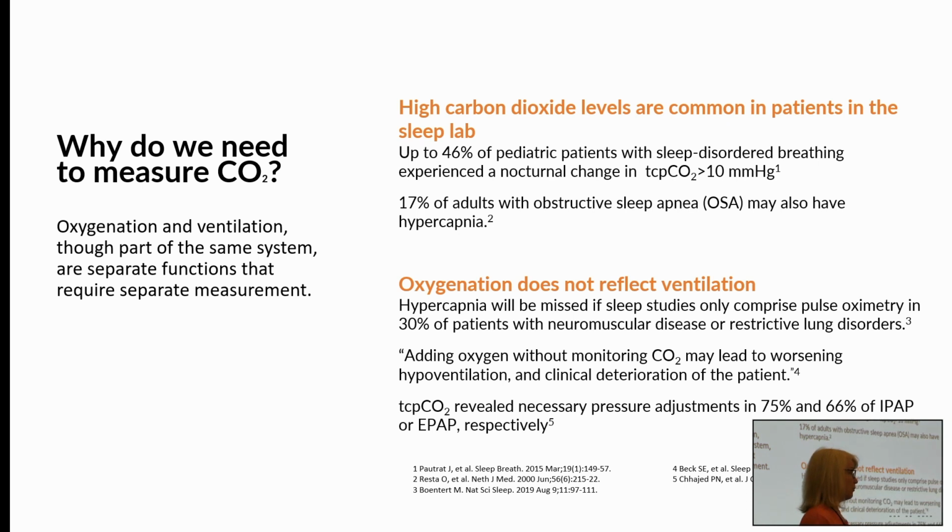Oxygenation does not reflect ventilation. As I said, they are separate functions of the same system. And it's been shown, and I'll show you some studies here in a minute, that hypercapnia will be missed in about 30% of the patient population if you're only looking at oxygen saturation. Also know that adding oxygen without monitoring your CO2 can lead to worsening hypoventilation, and we really see that in our COPD patients. That's one of the first classic things they teach you in respiratory school.